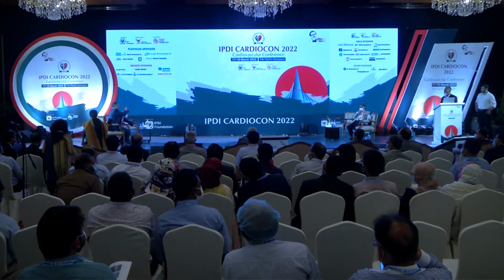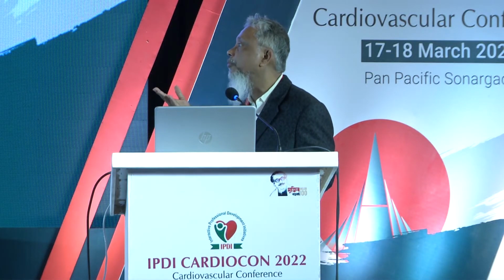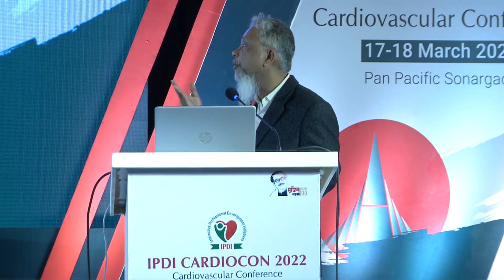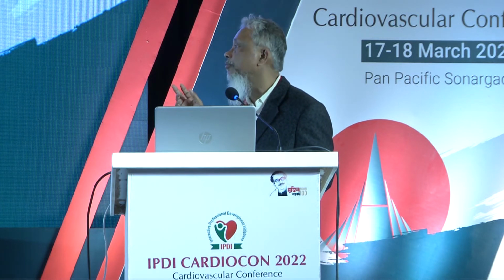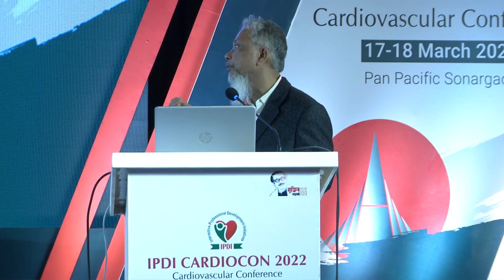My question is, the pulmonary artery pressure that we measure, will it be at rest or during stress? It is a good question, sir. It can be normal at rest, but if we exercise the patient with a bicycle ergometer, and if the patient has an increment of 30 millimeters of mercury, then we know that the patient is not having uncoupling, at least. And if the systolic pressure crosses 50 millimeters of mercury, then we know that this patient might have latent pulmonary hypertension. We measured this pressure during rest.